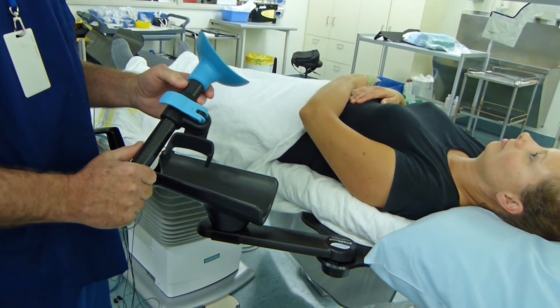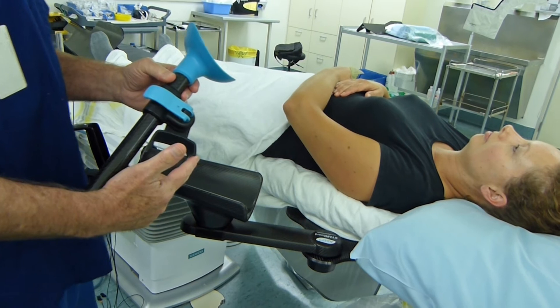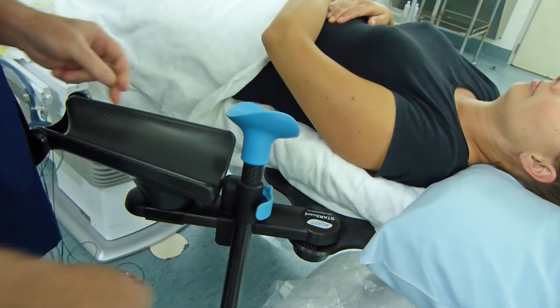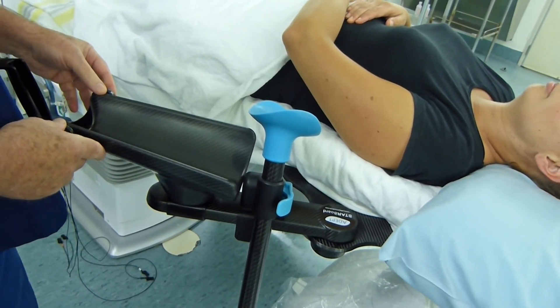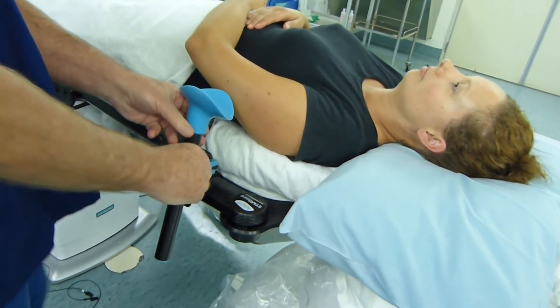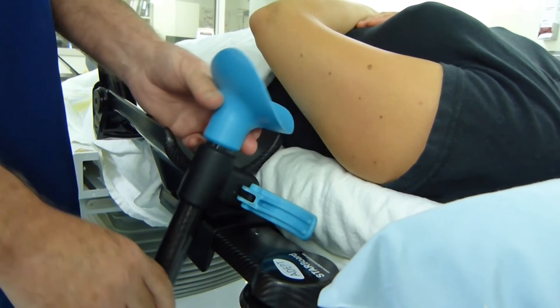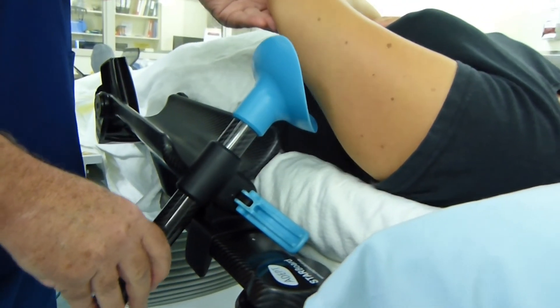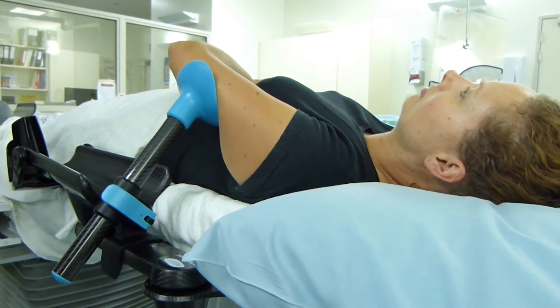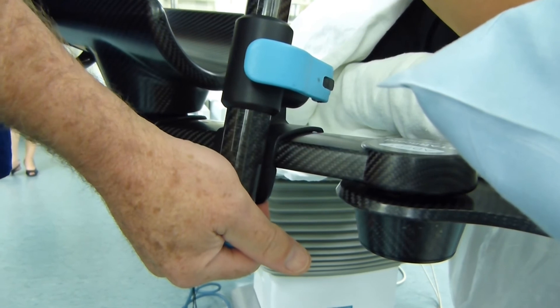When positioning the arm support, it is important that the inner clip of the arm support is positioned first as close to the forearm support as possible and clicked back into position. The entire starboard is then moved medially to lie parallel with the cath lab table. The arm support has an adjustable lever that provides adjustable height and angulation so that the left arm can be positioned in an optimum position that is both comfortable for the patient and in an optimum working position for the operator. The arm support can be disengaged from the slider arm as follows.